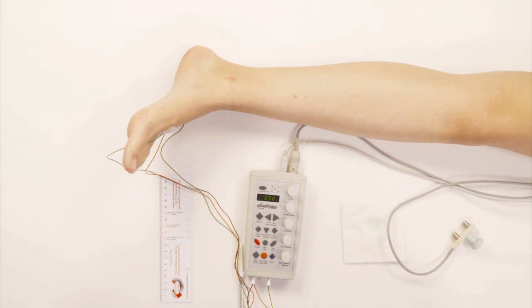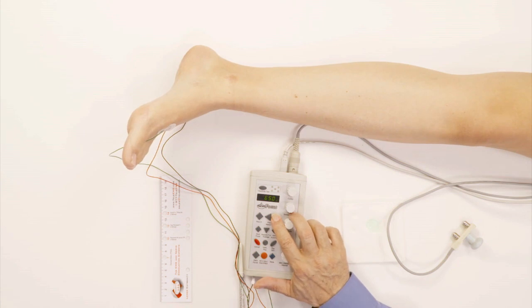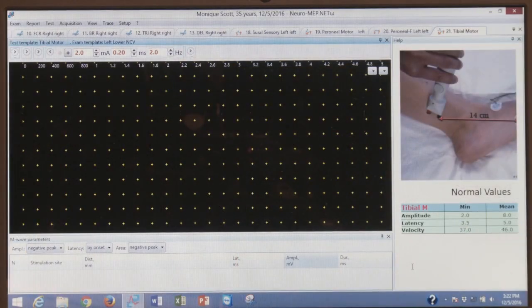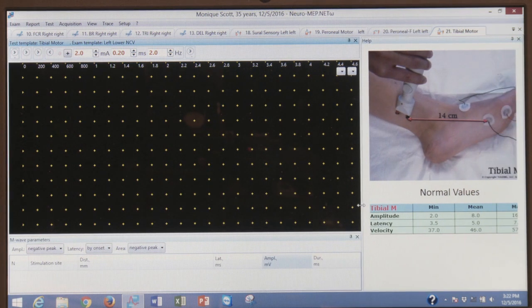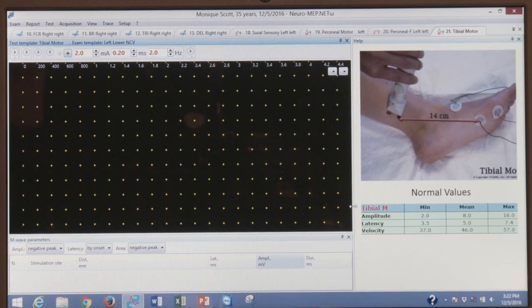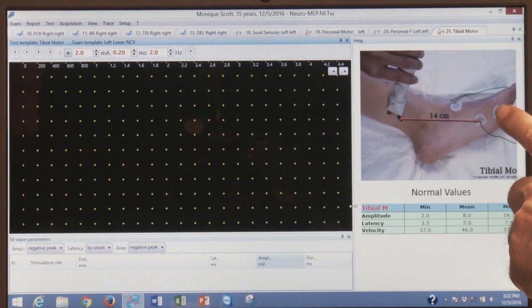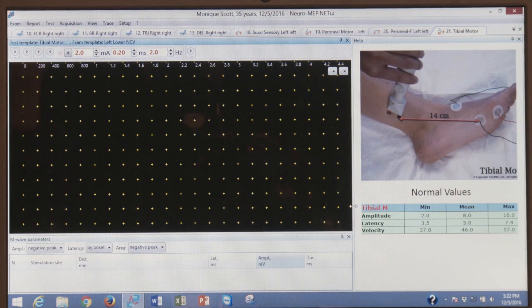The next nerve we're going to do is the tibial nerve. I press next and now you're going to see the tibial nerve pop up here. We stimulate the tibial nerve at the ankle, right behind the ankle. Here's where we put the electrode. We put the black right below the bone right here, the foot bone. And we put the red electrode right on the bone itself.